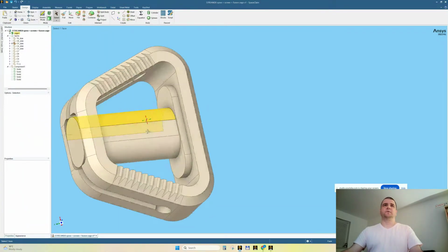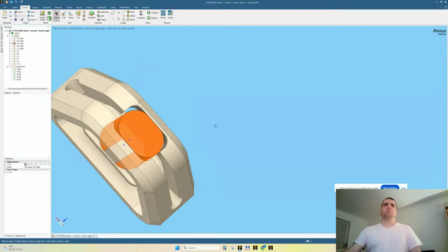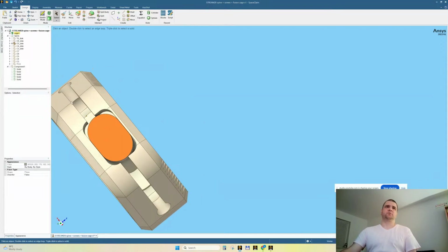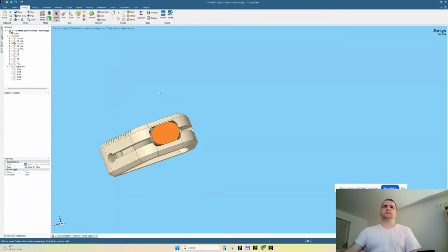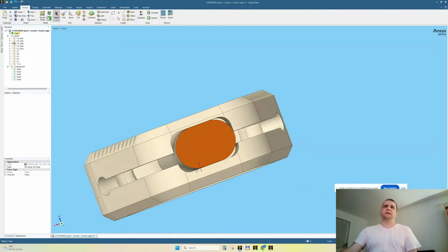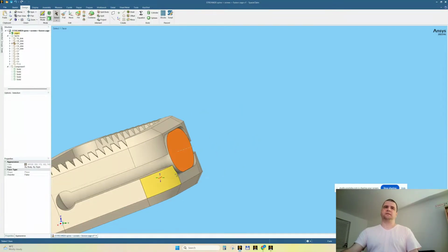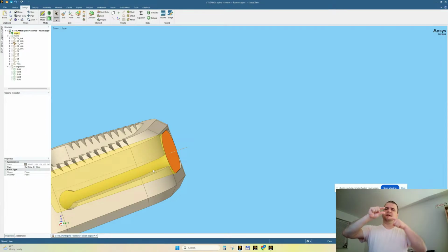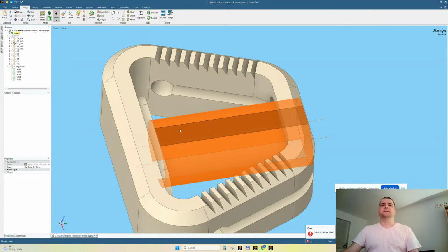Just for fun, is there a way to remove also this? Why am I talking about this? Because if I leave this, then it will not be flexible. This should be like a spring. There will be a top compression, let's say, or from the bottom. If I have this big protrusion here, it will limit the spring effect because I would like this gap to close. Now it's like this, and because I have this in the middle, I am limited. So if I remove this bolt, then I can have the spring effect.